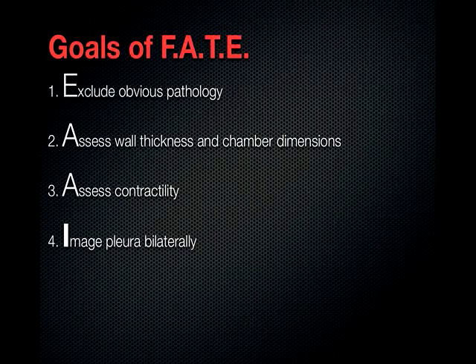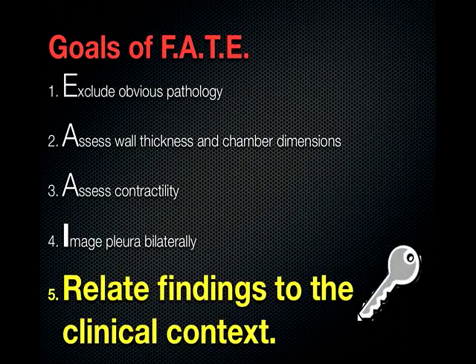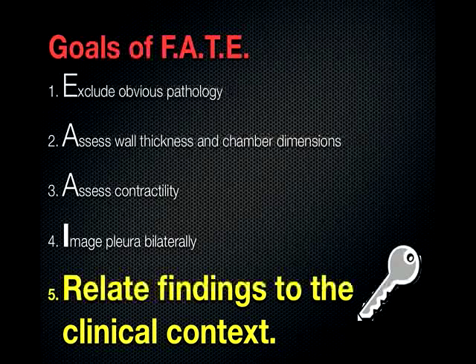But the most important goal of F.A.T.E is to relate the findings to the clinical context. Every time we approach a patient with point-of-care ultrasound, we should have a question in our mind. The question being anything from, why is this patient hypotensive? Why is this patient short of breath? Do they need more fluid? Do they need diuresis? You should always approach the patient with a question. And then when you get your images, you should relate the findings to the clinical context of that patient.